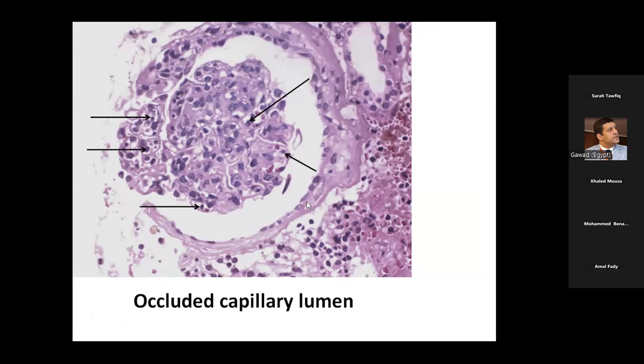The nuclei that we saw in the picture of the endothelial injury were large and of light color. These nuclei are smaller and of darker color. Can you appreciate this difference? Yes, it's clear. Okay. One of the cells that we like to see is the neutrophils. Can you see this nucleus? Can you describe it?